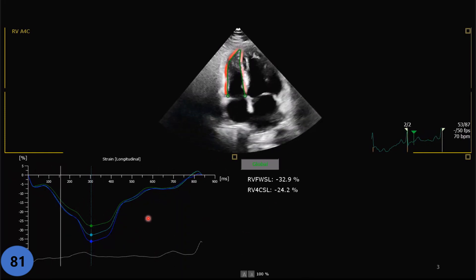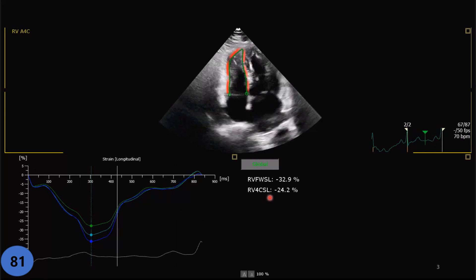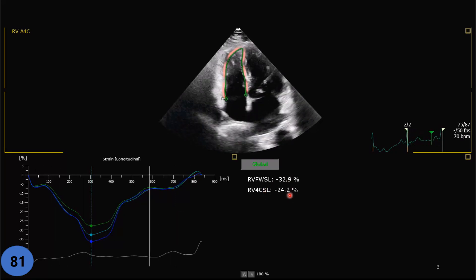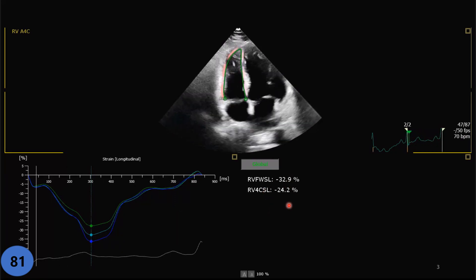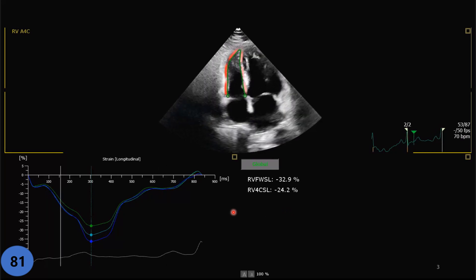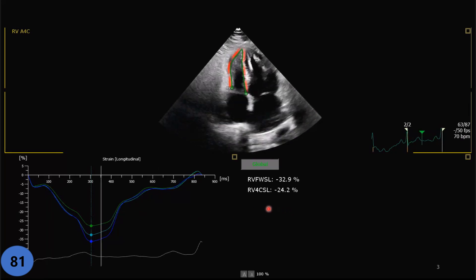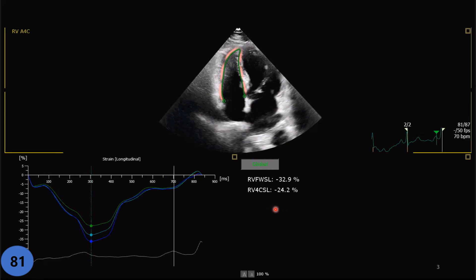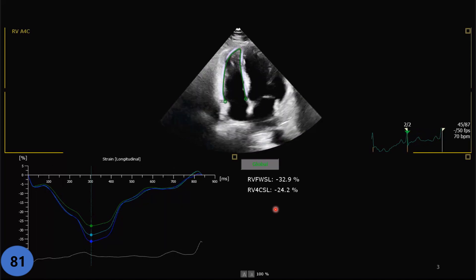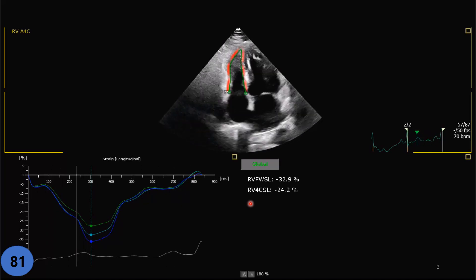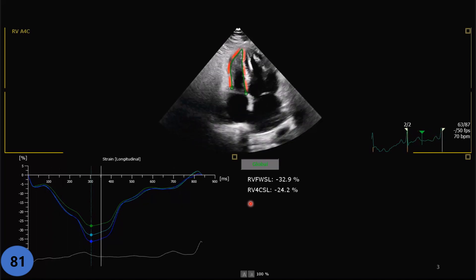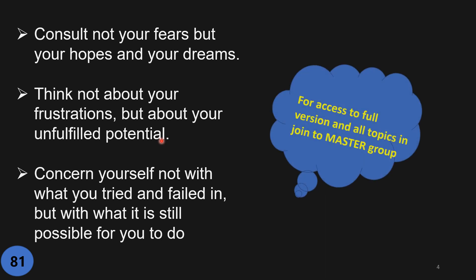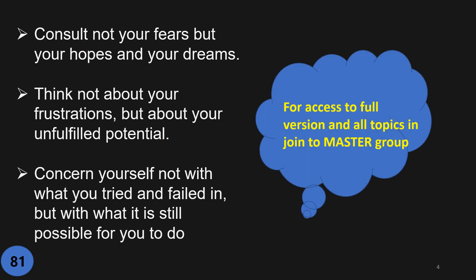The machine gives you global longitudinal and circumferential strain — this software has both, depending on what software you work with. The normal value will be minus 20 or above, typically minus 25 to 30. Enjoy the rest of your day and have a good time.